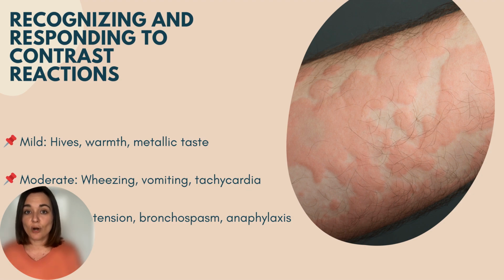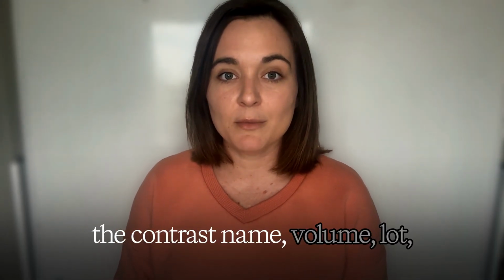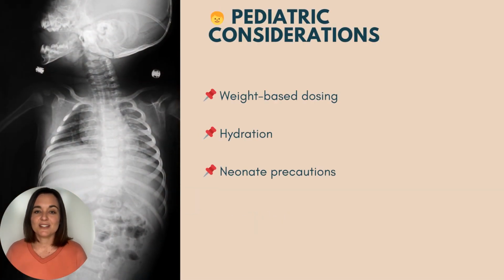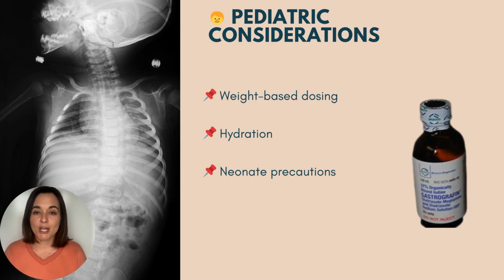Administer oxygen or epinephrine per protocol. And remember, you must document the contrast name, volume, lot number, expiration date, and whether a reaction occurred. Pediatric considerations. Children aren't just tiny adults. Their fluid balance, GI motility, and reaction risks are different. When using hyperosmolar contrast like gastrographin in kids, always follow weight-based dosing. Ensure good hydration before and after, and never use undiluted gastrographin in neonates.